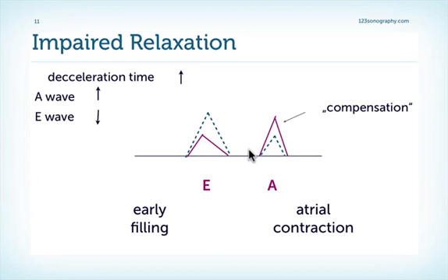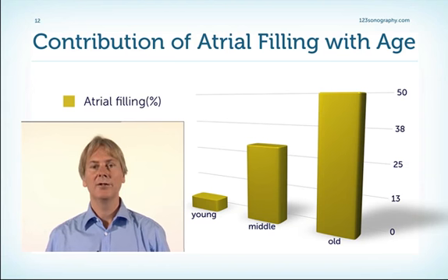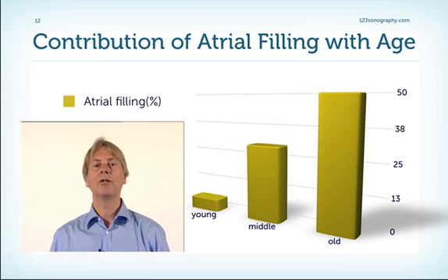We have a lot of residual volume of blood in the left atrium during the late phases of diastole, and those are pumped into the left ventricle via atrial contraction. What else is here to mention? We have a fairly long deceleration time. Remember, we usually have normal or only mildly elevated left ventricular filling pressures. This pattern is called impaired relaxation. So the size of the A wave, and in particular the area under the A wave, so nicely reflects the component of atrial contraction for left ventricular filling.